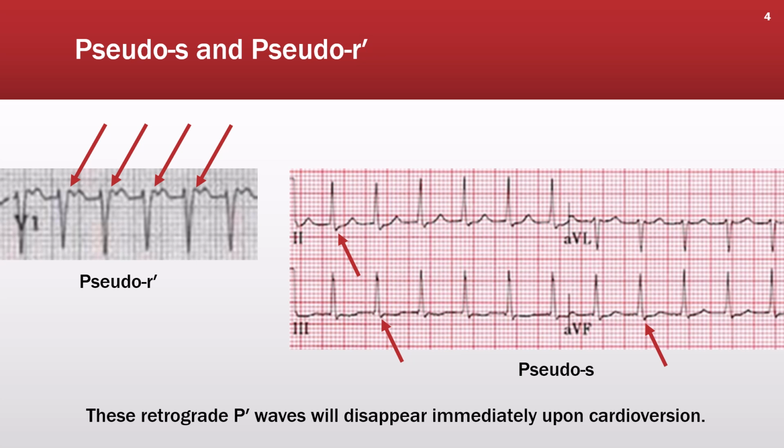We should be referring to these P waves in general created by the reentrant tachycardia as P prime waves. Only P waves created by the sinus node have the right to be called P waves. P waves originating anywhere else are correctly referred to as P prime waves.